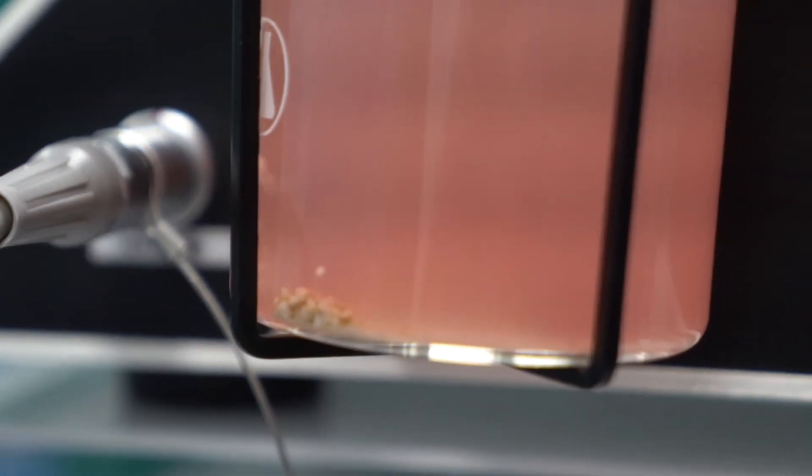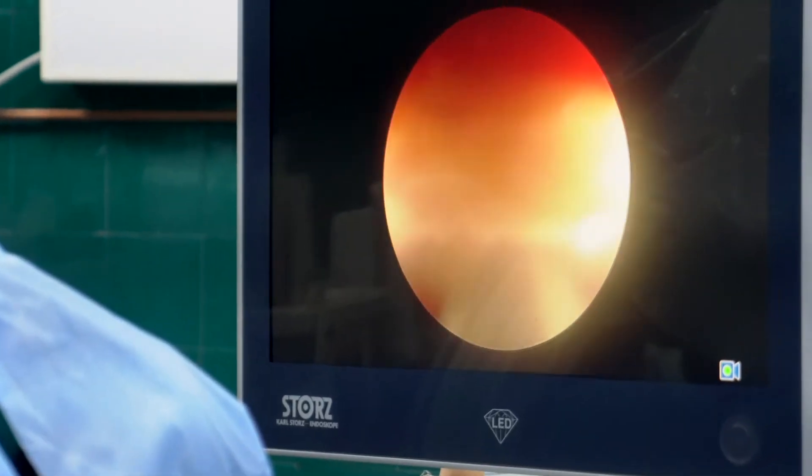We have a stone around six centimeters in this case, and I believe it will certainly be done in less than 30 minutes with this device.